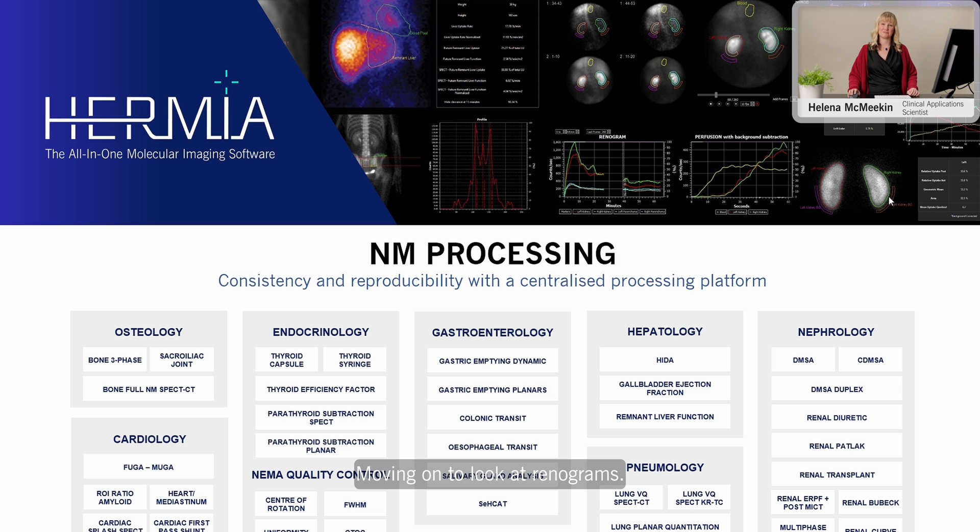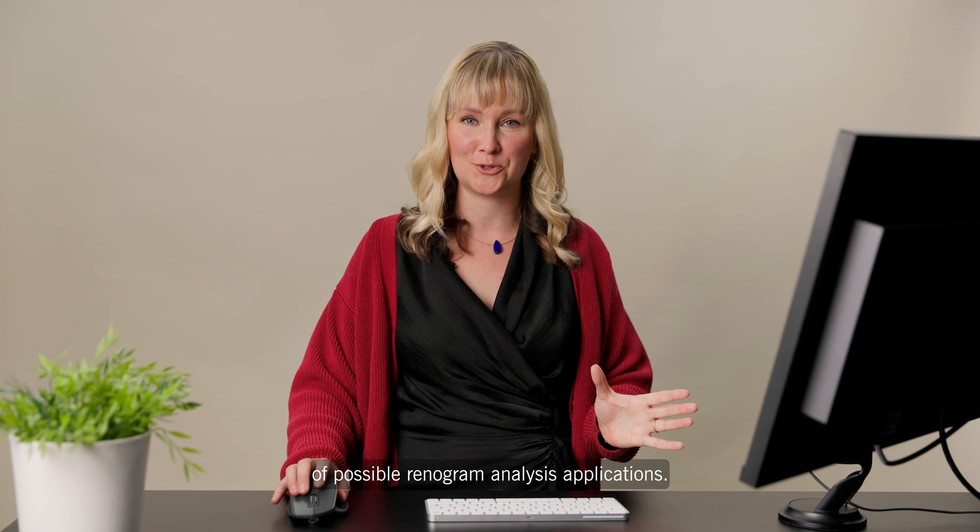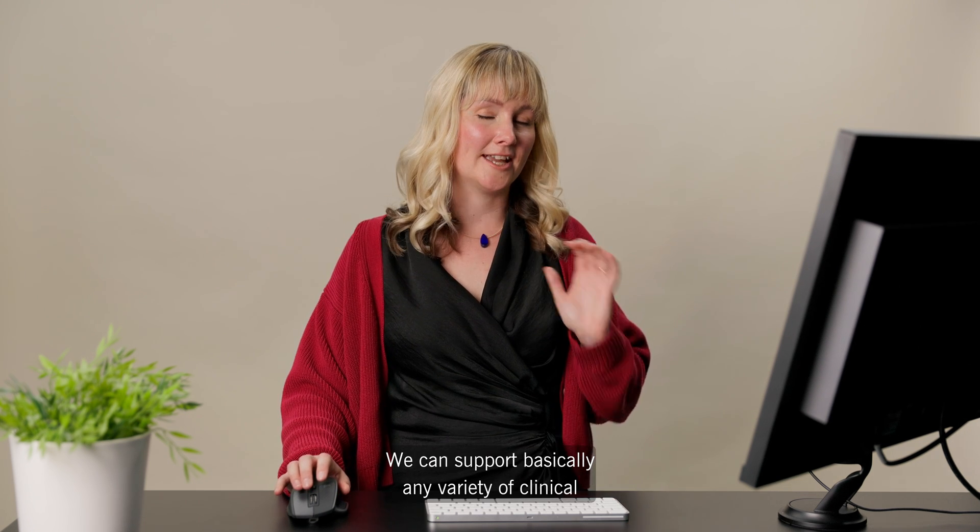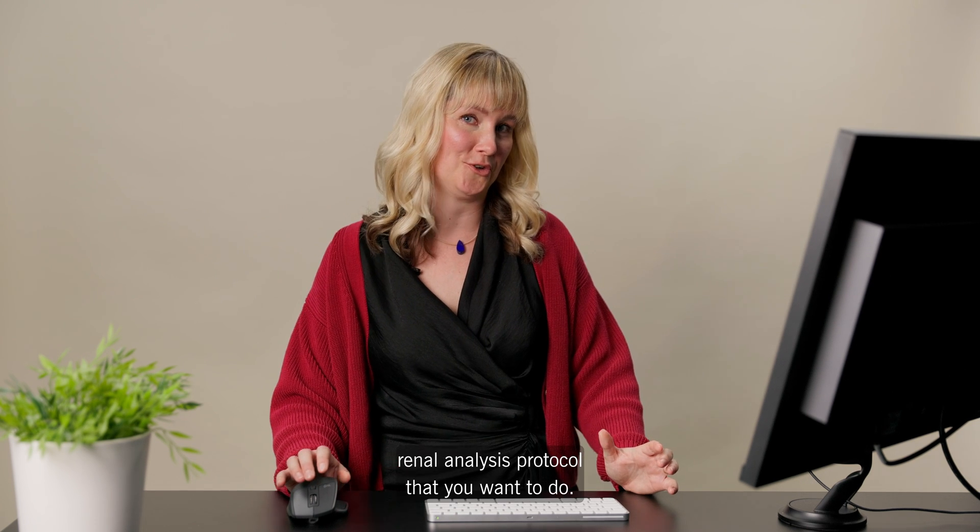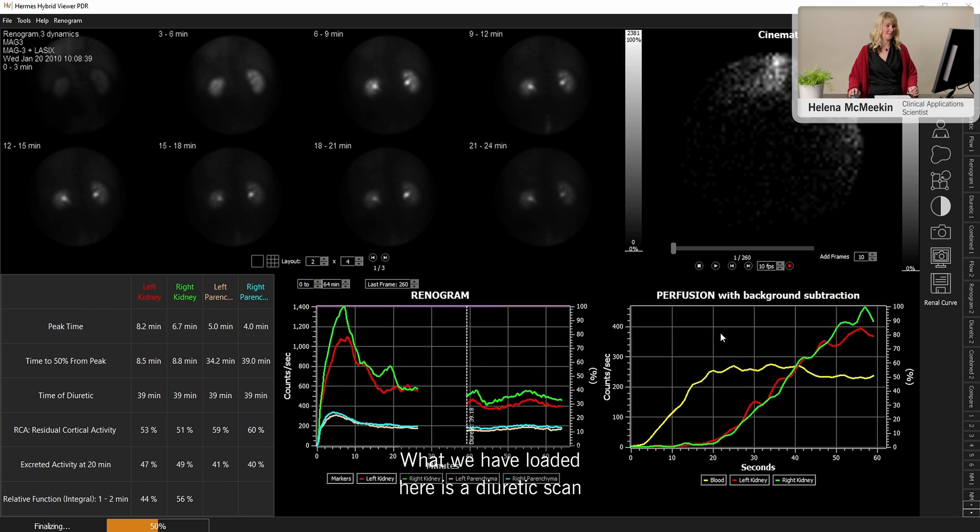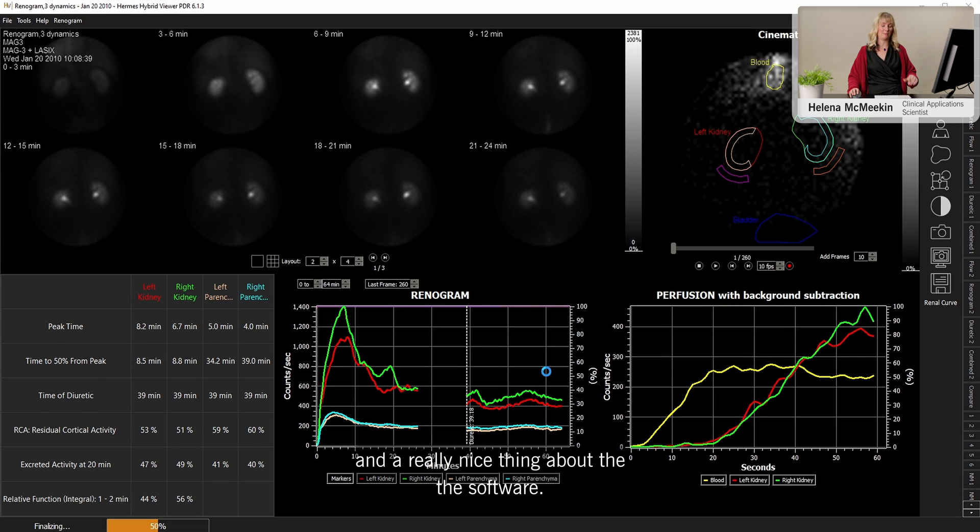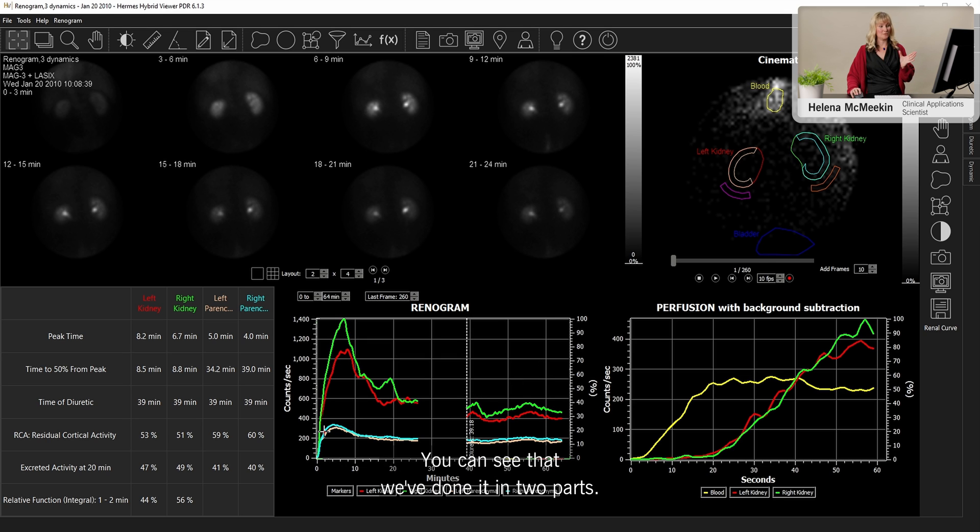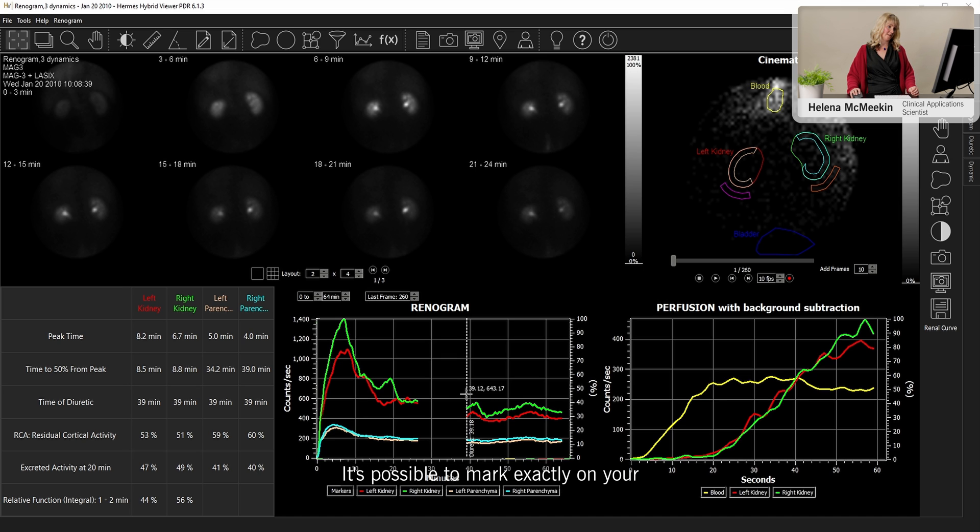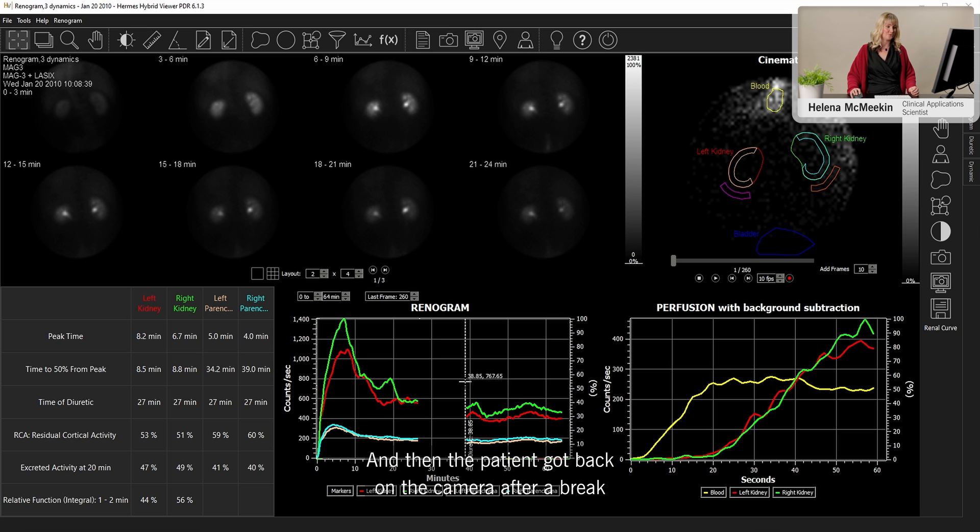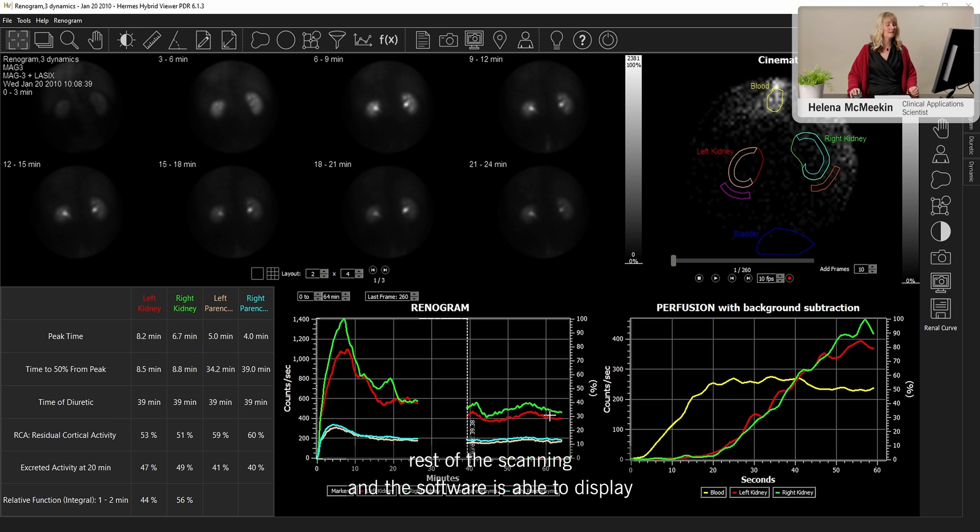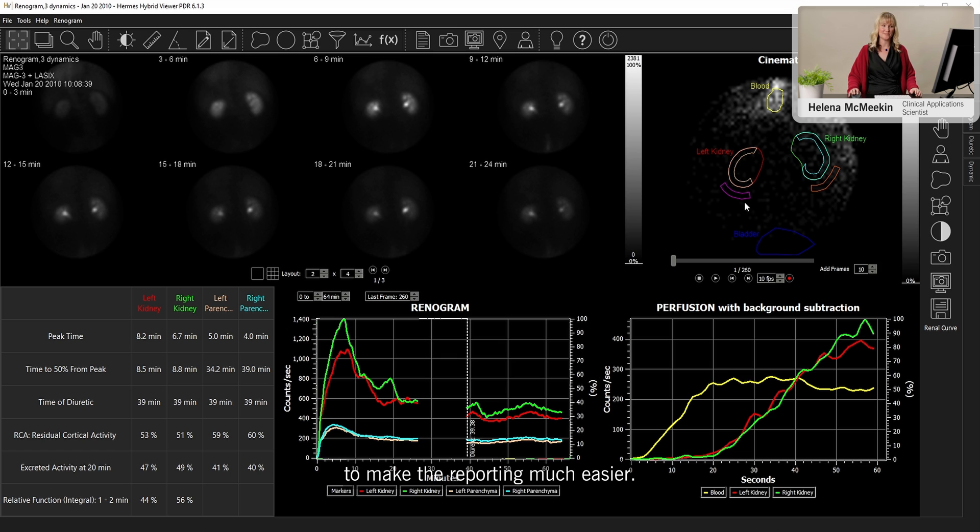Moving on to look at renograms. Hermia has a huge range of possible renogram analysis applications. We can support basically any variety of clinical renal analysis protocol that you want to do. What we have loaded here is a diuretic scan. And a really nice thing about the software, you can see that we've done it in two parts. So we have an initial phase, then there was a diuretic injected. It's possible to mark exactly on your renogram curve where that diuretic was injected. And then the patient got back on the camera after a break to have the rest of the scanning.